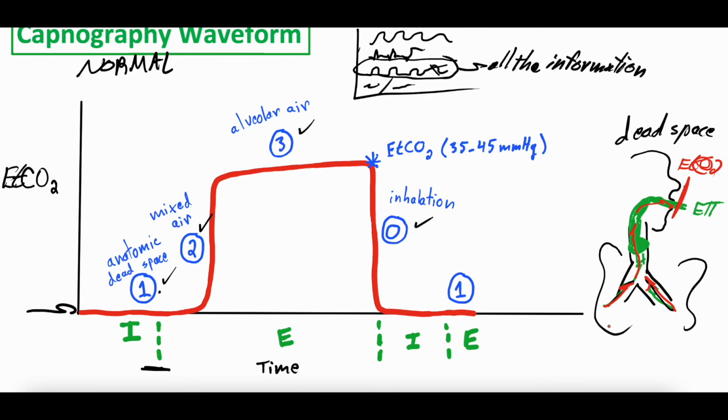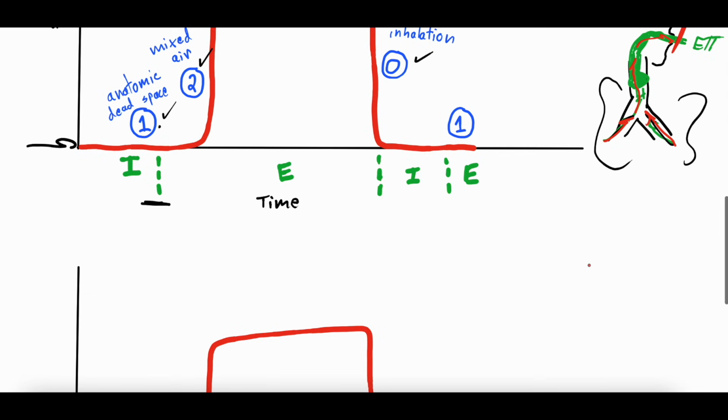So let's pretend the whole system is a pipe. If I breathe air into the pipe, all the way down to here, this is just air that is not containing any exchange gas, whereas the exchange gases are lower by the alveoli.